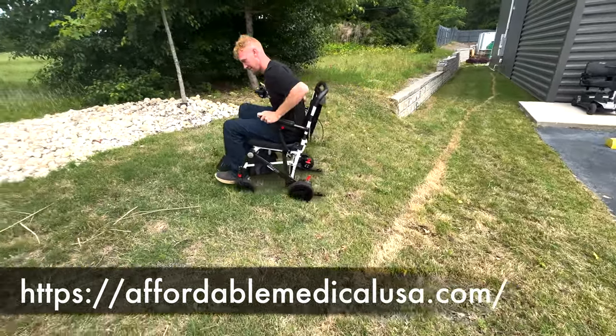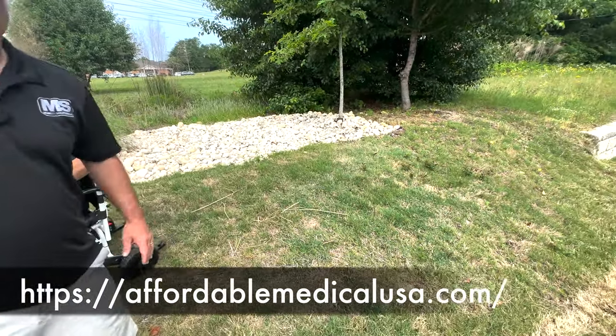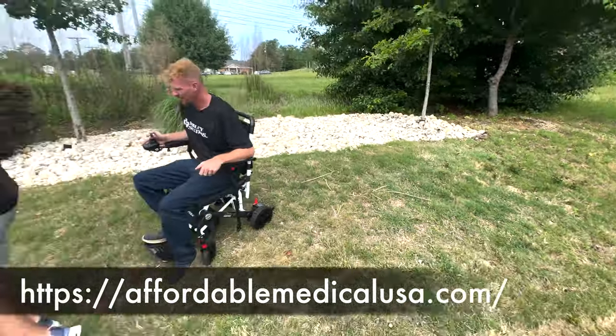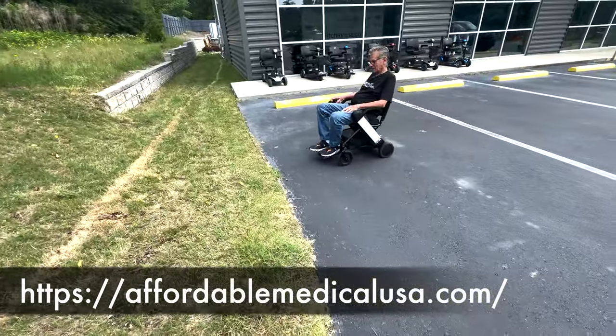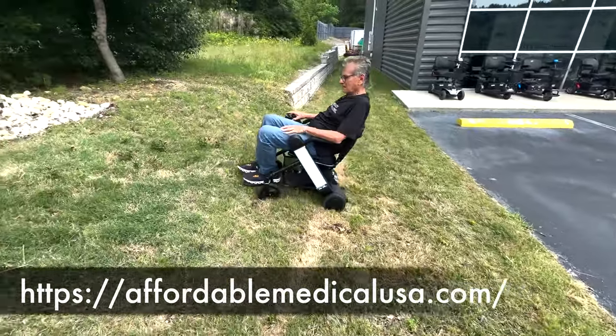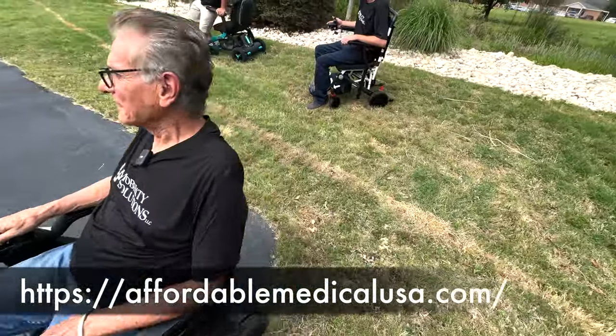And lean forward. Wow. That's all right. It did it. It's struggling. See how it's still moving a little bit? This one felt more secure. See how it comes back down? I think this one did better.